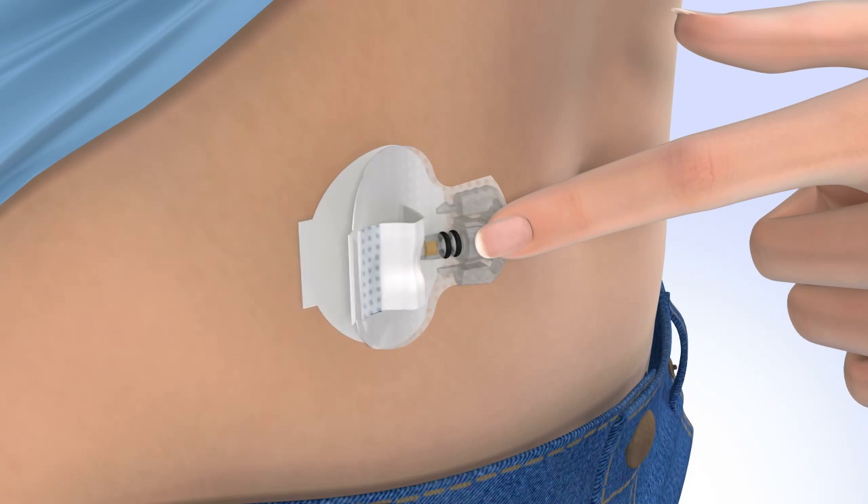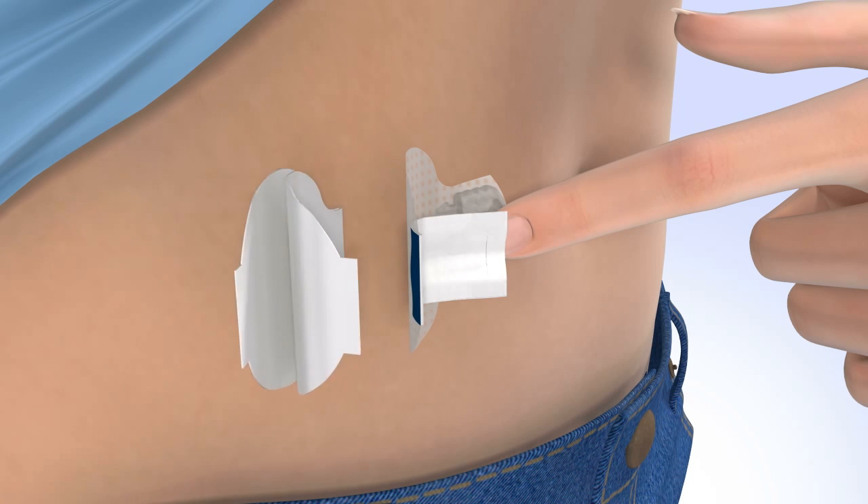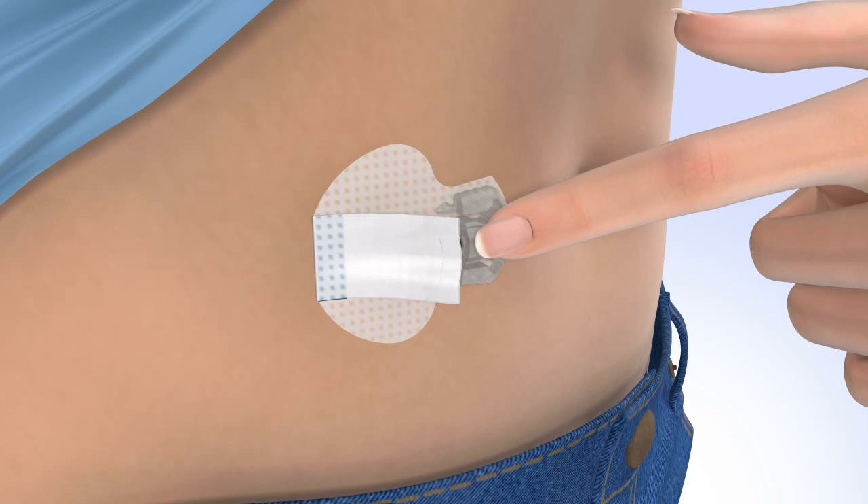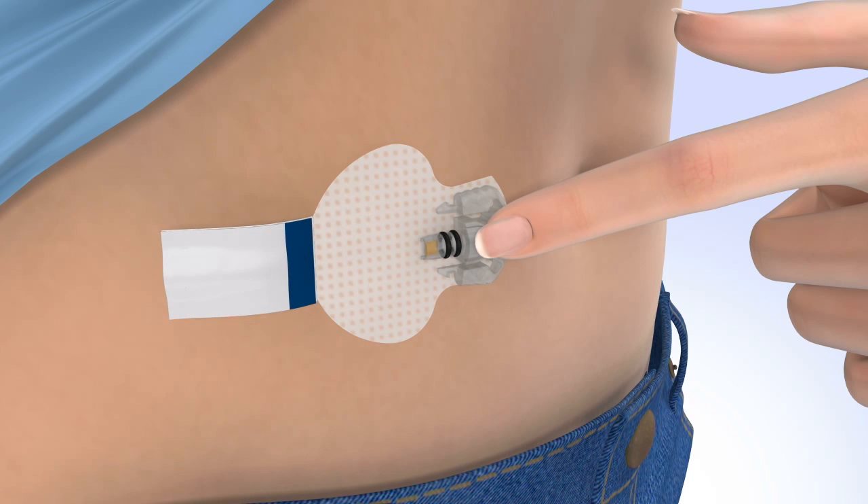Carefully remove the adhesive liner that is located underneath the curved adhesive pad. Press the adhesive against the skin. Now flip the adhesive tab so that it lies flat against the skin, but do not remove the adhesive liner just yet. Next, you will need to apply the overtape. Because the sensor is small, it is important that you apply the overtape that came with the sensor. Applying the overtape can help prevent the sensor from pulling out of the skin.